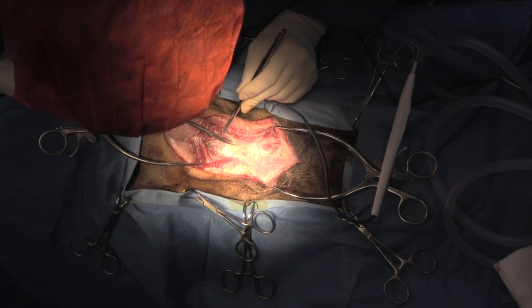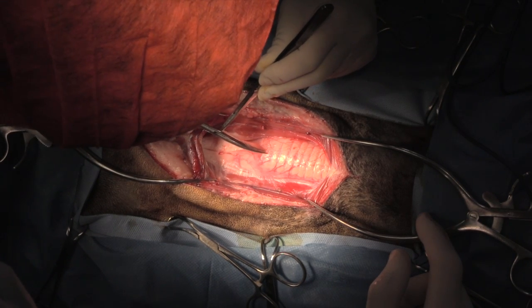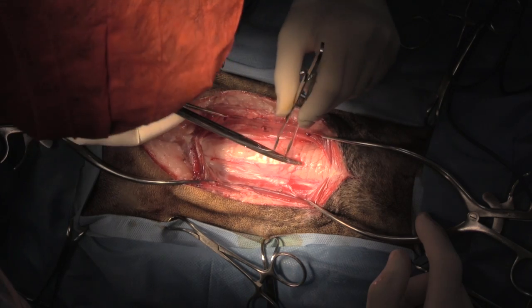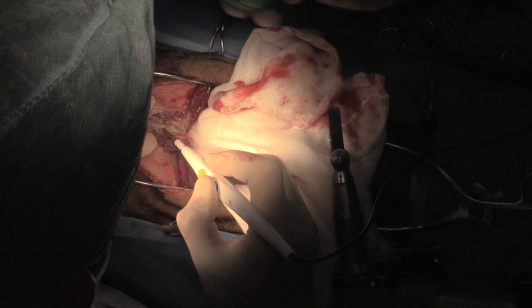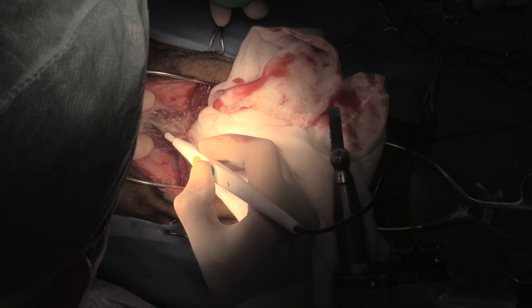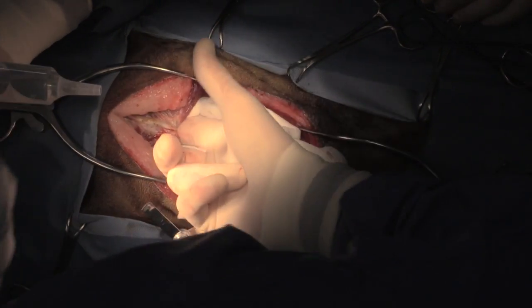At this point we're starting the midline thoracic exploratory in order to identify and resect the mass. The manubrium was split in order to allow better access to the intrathoracic portion of the trachea.